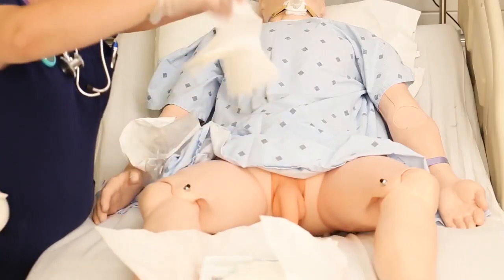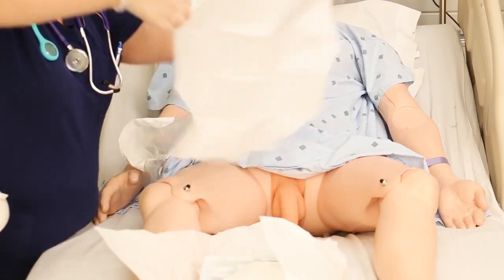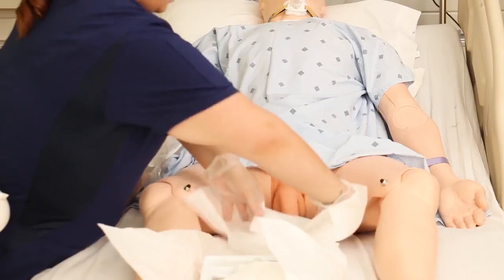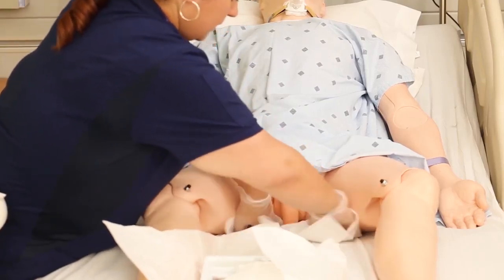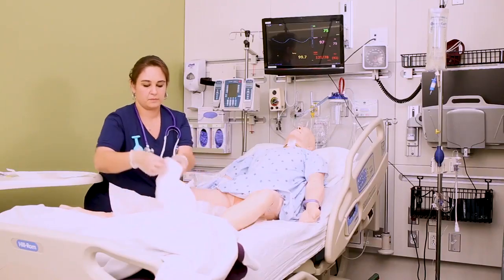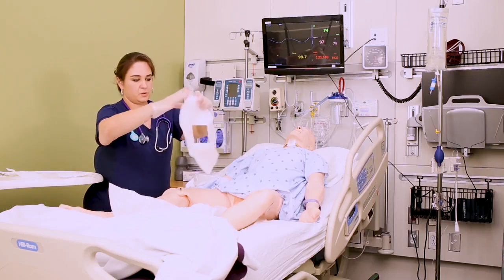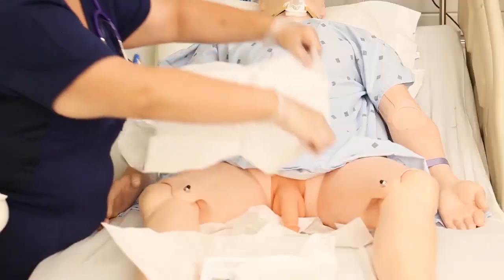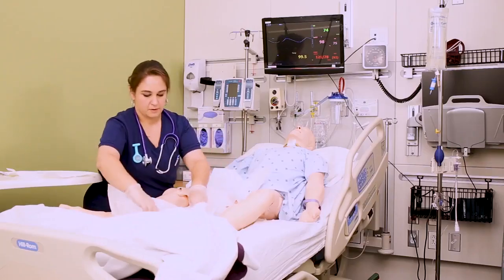Grab the full drape out of your sterile field, wrap your hands up in it, and place it under their perineum without touching their skin or the sheets — shiny side down. Then grab the fenestrated drape, which is the drape with the hole in it, and place it over the patient's perineum gently without touching the patient's skin. The whole goal here is to give yourself a nice big sterile field to work with.